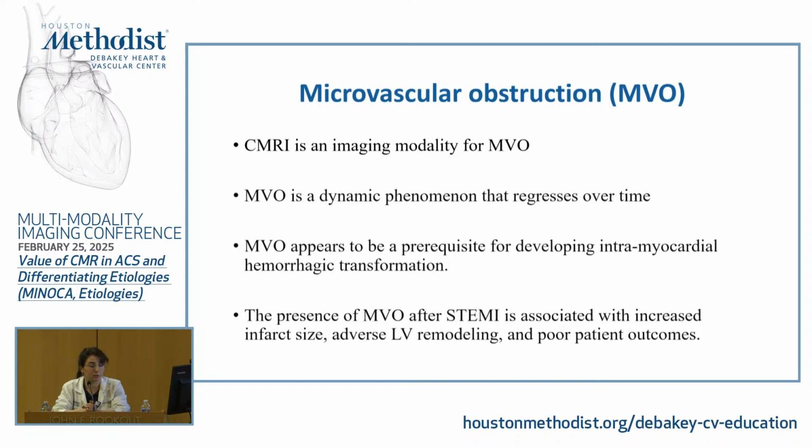It is a dynamic phenomenon. This is a little bit different from what Dr. Shah said. Dr. Shah was saying that even during the scan, initially we can see perfusion just on the edges and not getting into the core because of obstruction, but with time the core will light up too. What I say here is about as more time passes, this edema will essentially resolve and cool down, so the scar that we see now will eventually turn into the classical scar, the more dense, connective-tissue-rich scar.